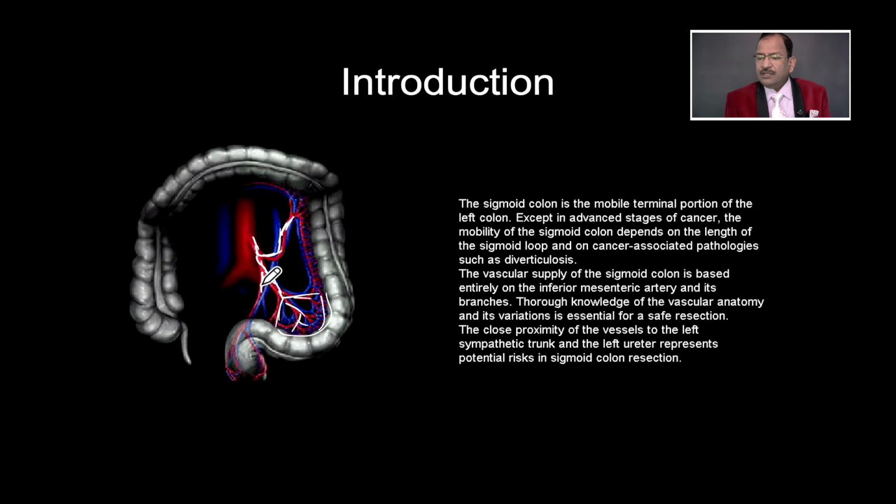Then you have the superior rectal artery, which supplies the upper half of the rectum.